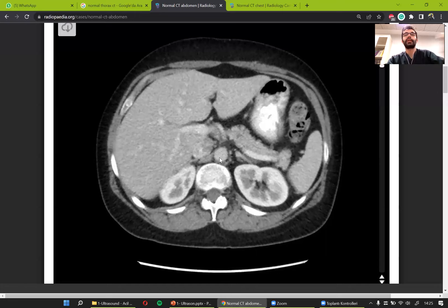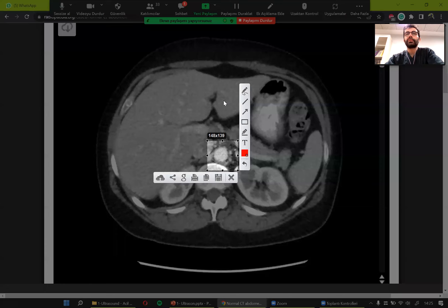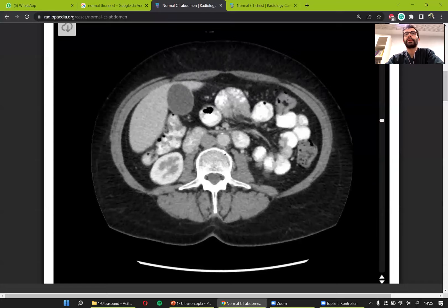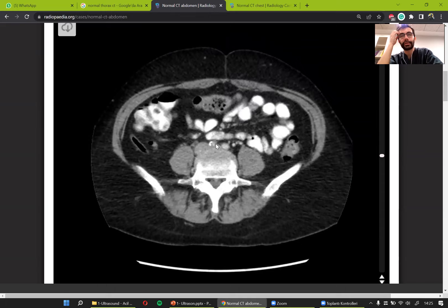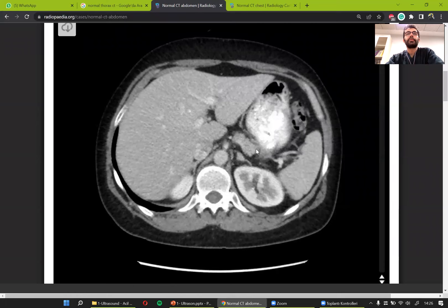I also see the aorta here — it made a round turn at the arcus and is now coming down. It will come down in front of the vertebra all the way until it divides into two vessels, which are the iliac vessels.